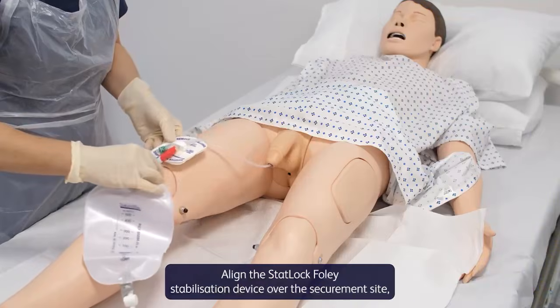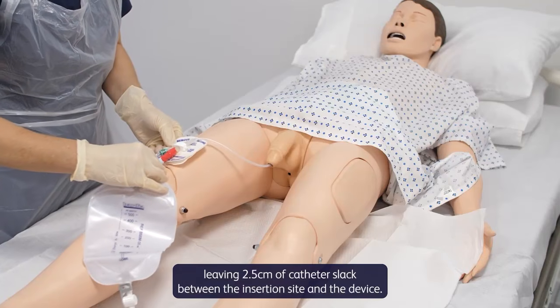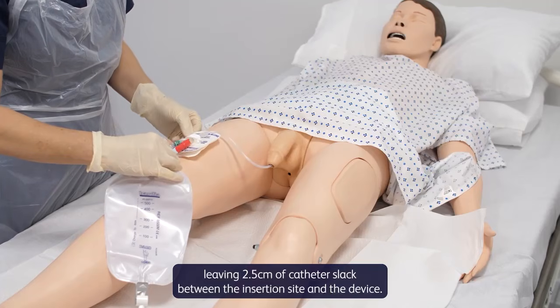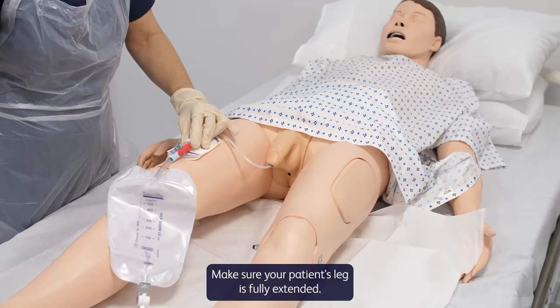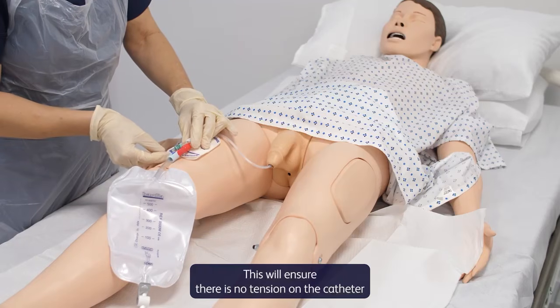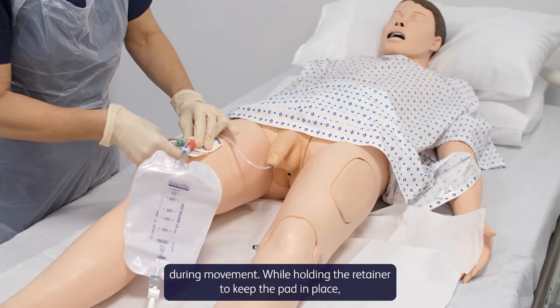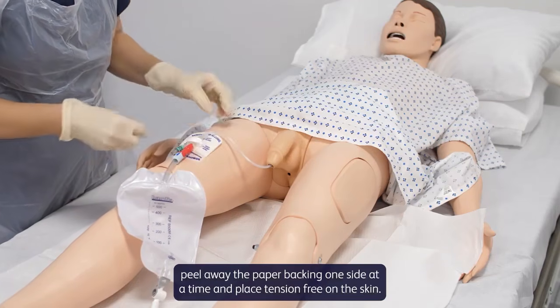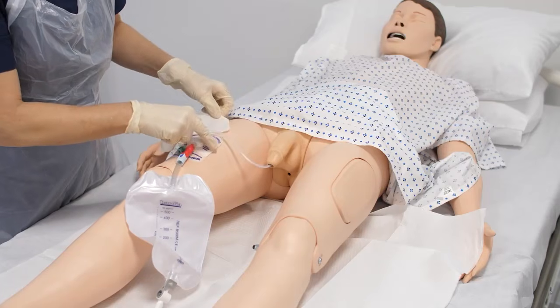Align the StatLock Foley stabilization device over the securement site, leaving 2.5 centimeters of catheter slack between the insertion site and the device retainer. Make sure your patient's leg is fully extended. This will ensure there is no tension on the catheter during movement. While holding the retainer to keep the pad in place, peel away the paper backing one side at a time and place tension-free on the skin.